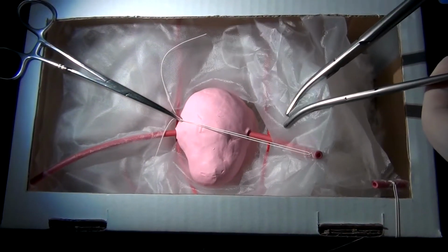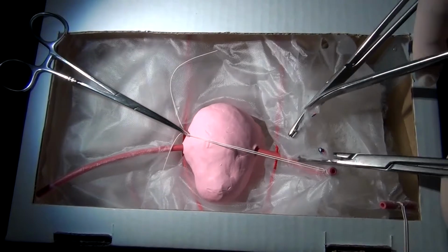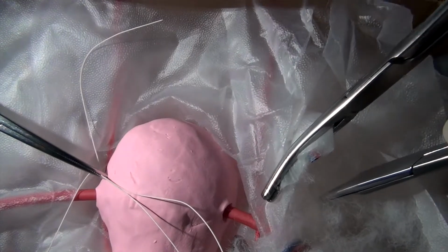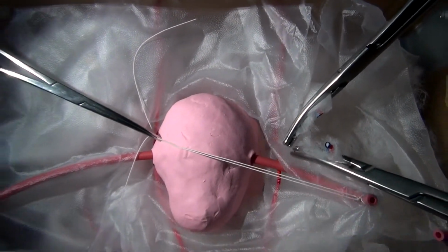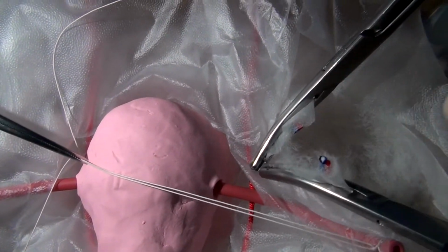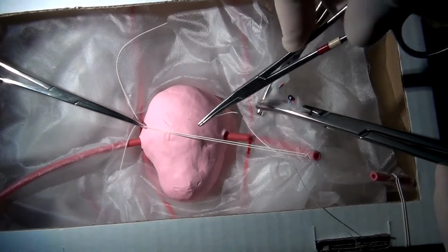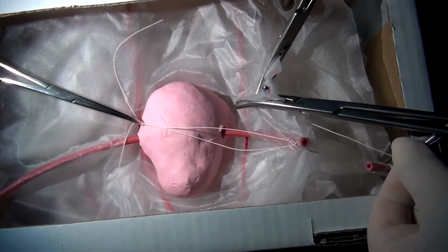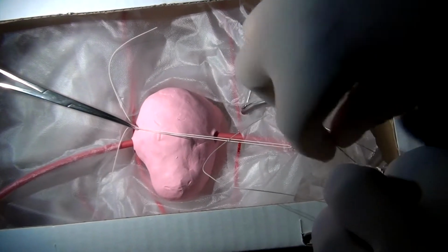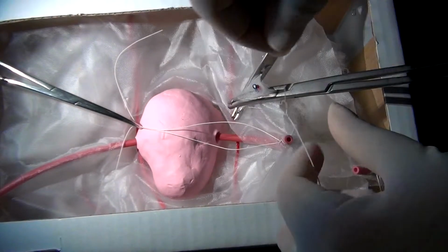Mayo scissors. I'm now going to cut my infundibulopelvic ligament. Again, my ureter is here. And we would not be using our scissors to show that, but for the sake of the simulation, I'm showing you that the ureter is here, distal to the infundibulopelvic ligament. So typically, we take a tie. So this is a 0 Vicryl tie. And I'm going to tie off my ligament with my ovarian vessels.